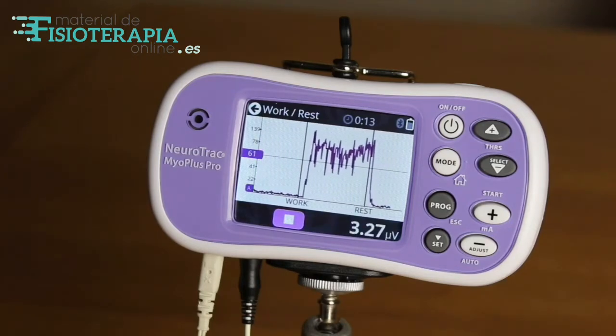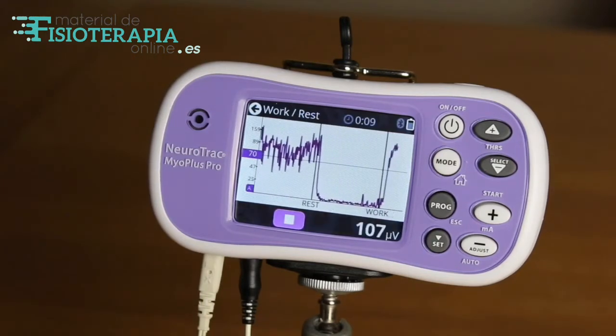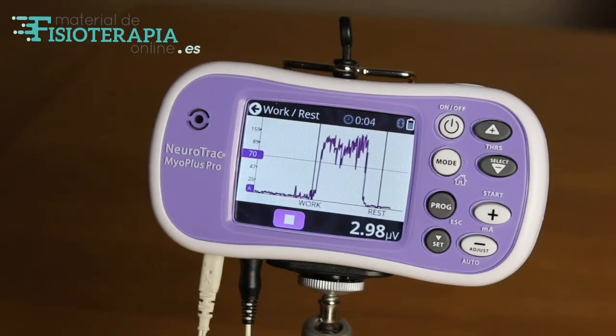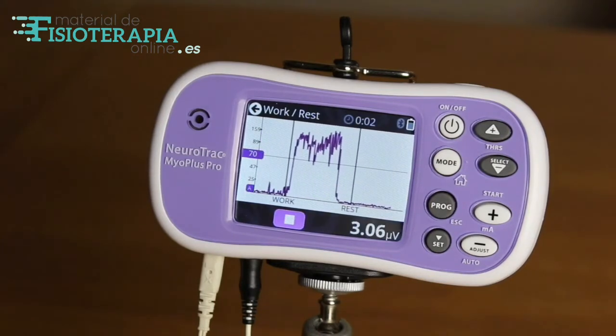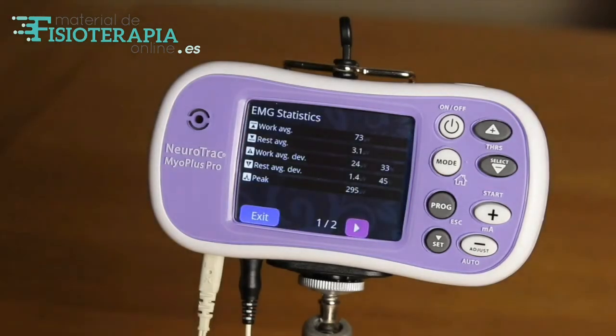At the end of the assessment, the EMG statistics are displayed on the screen. Over a period of time, the work-rest assessments can be repeated as the muscle becomes stronger and fitter. This can be really encouraging and a strong motivating tool as statistics improve.